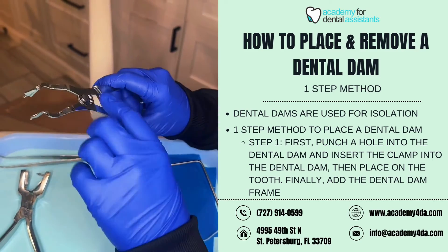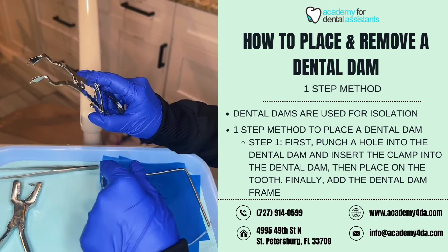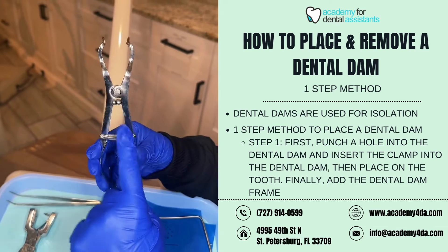The beaks allow you to place the forceps into the holes inside of our dental dam clamp itself. When you squeeze it, it will open bigger so that you can widen your clamp to fit around the tooth. It also has a locking key — the further you push it down, it will lock into place.